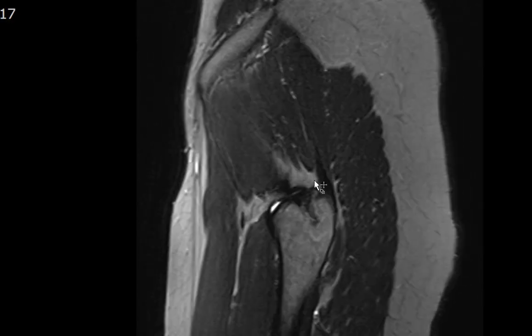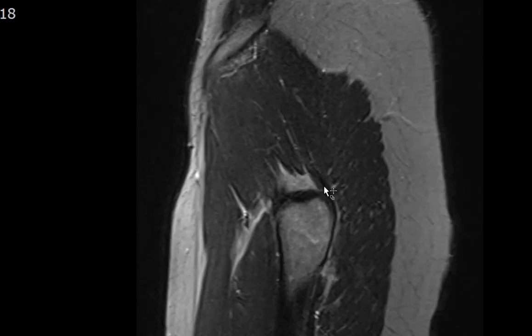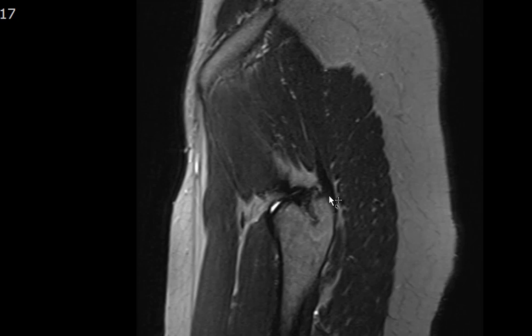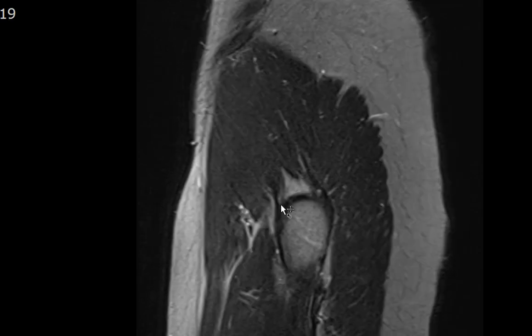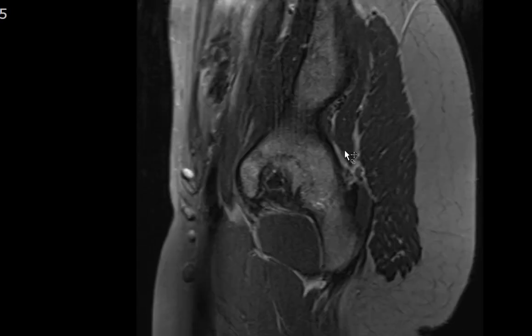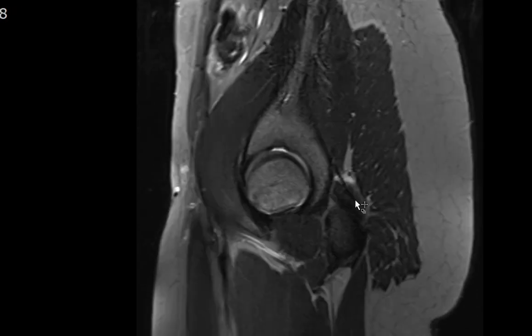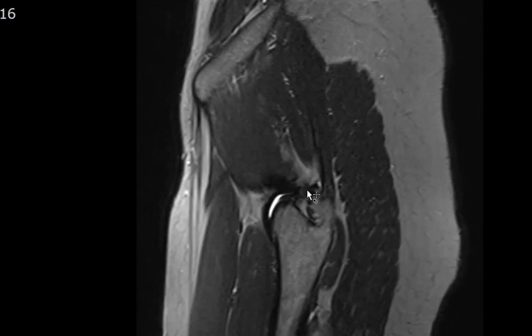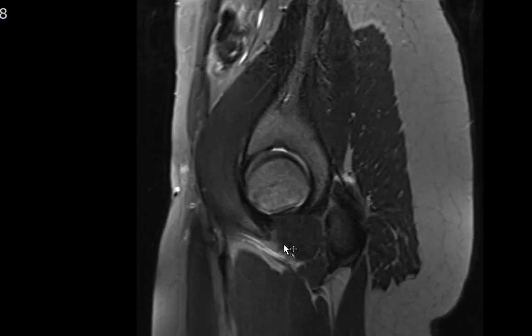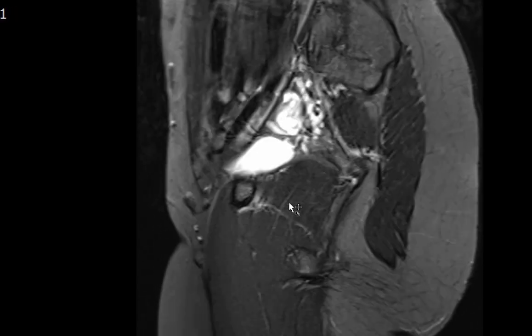On the sagittal image, the gluteus medius tendon inserts onto the posterior superior facet of the greater trochanter. The gluteus minimus tendon inserts onto the anterior facet of the greater trochanter. Other tendons include the piriformis, inserting onto the piriformis fossa; the obturator internus, inserting onto the piriformis fossa; and the obturator externus, also inserting onto the piriformis fossa. Many tendons are inserting normally onto their respective locations here.